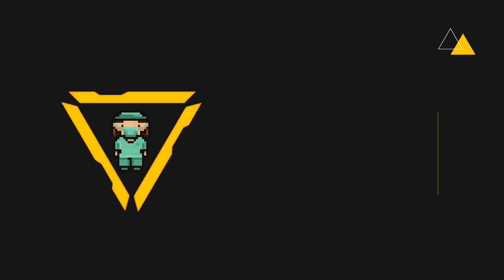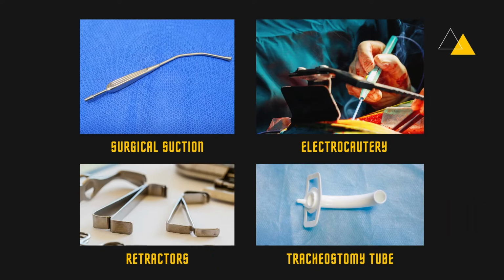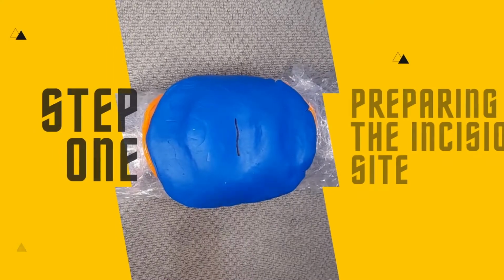Materials needed: syringe and anesthetic, forceps and gauze, scalpel and tissue forceps, needle holder and silk suture, surgical suction, electrocautery, retractors, and tracheostomy tube.